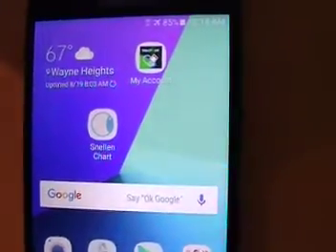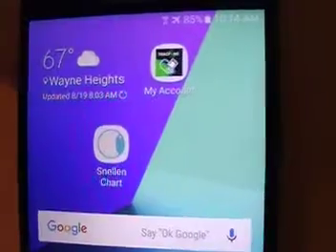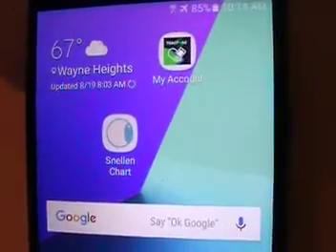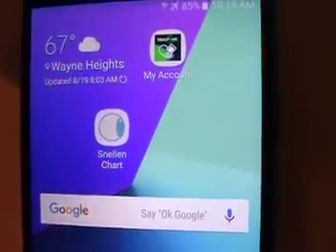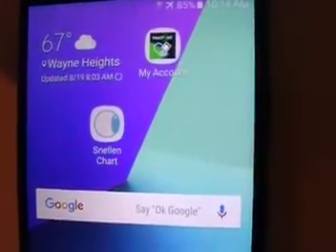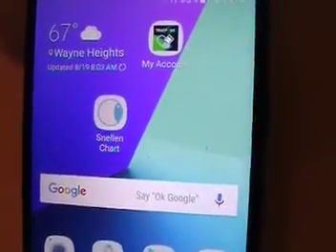There is the program downloaded, Snellen chart. So let's open it up.